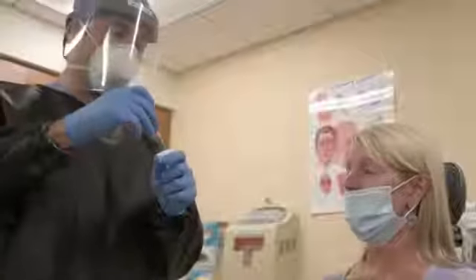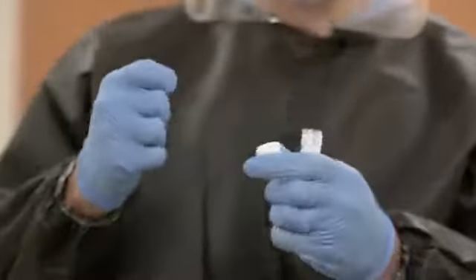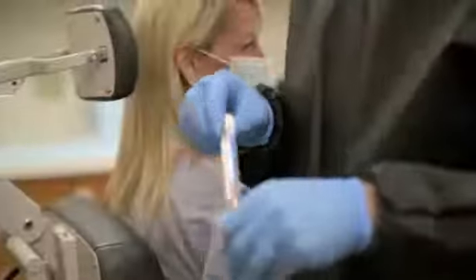The swab is then placed inside the transport media, broken off at the natural cleavage plane of the swab. The final step, fastening the cap on the transport media test tube to ensure no spillage during transportation. The tube is then sent for the lab to be tested.